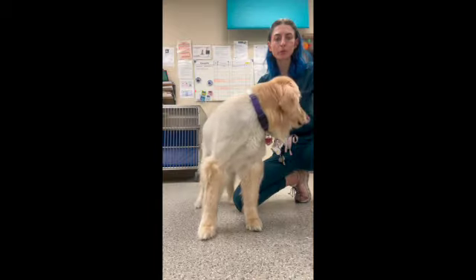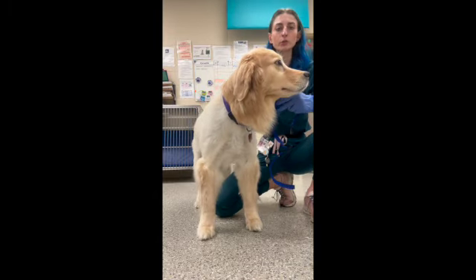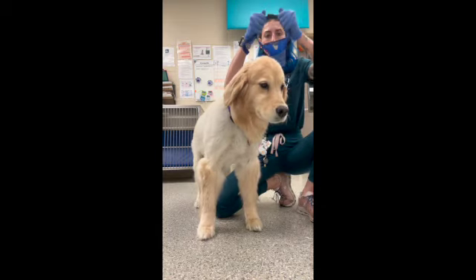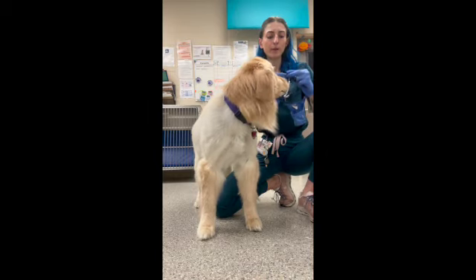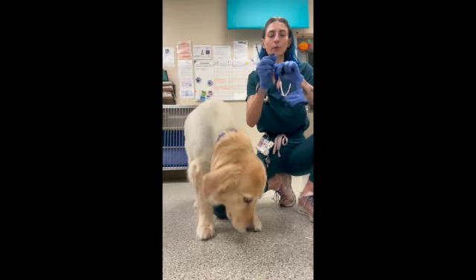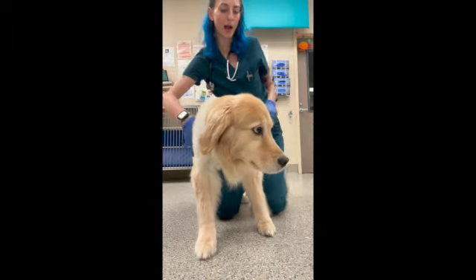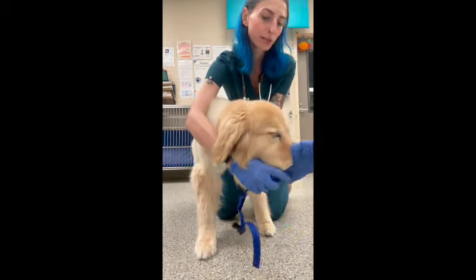You want to make sure that the muzzle appropriately fits your patient, and that the patient is not able to open their mouth to bite. When you choose your muzzle, make sure it works appropriately and is able to clasp appropriately. Before I apply it to my patient, I make sure I let it out so it's nice and loose and long. When you apply it, you want to come behind your patient and underneath in a swift motion like so.